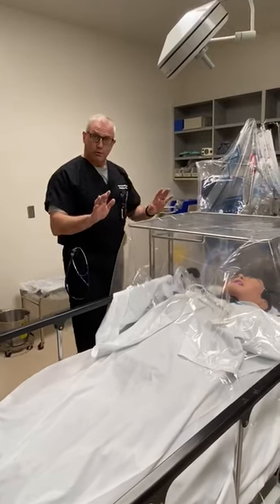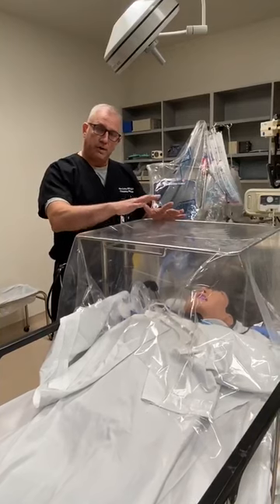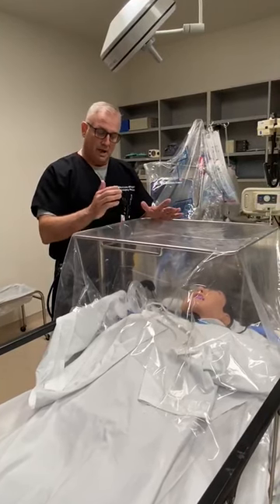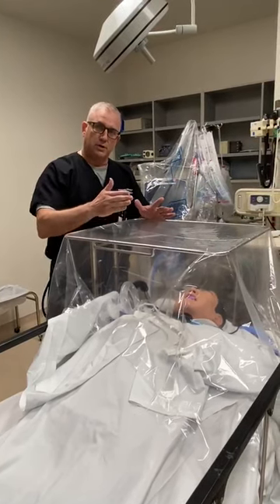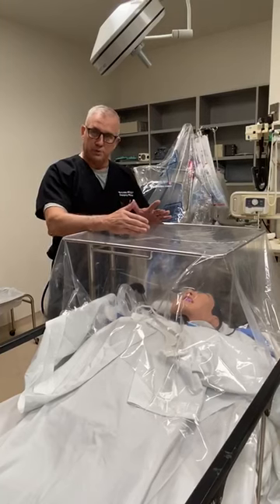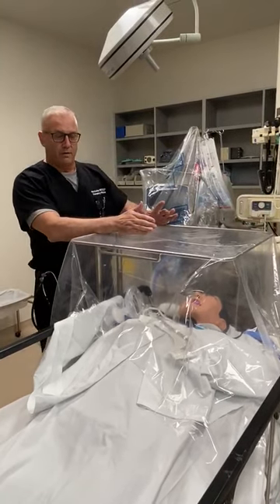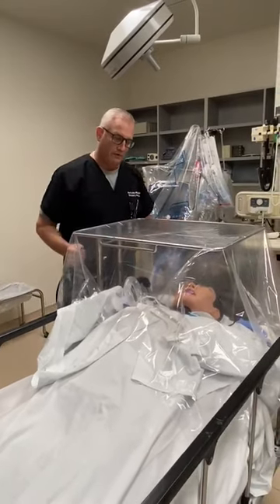The most important thing about this process is before you start the procedure you want to make sure you have everything underneath your tent that you're going to need — everything from your bag valve mask device, your suction, your endotracheal tube, your laryngoscope, as well as the tubing that you're going to use for the ventilator. That way everything is enclosed underneath here and you don't have to come out.